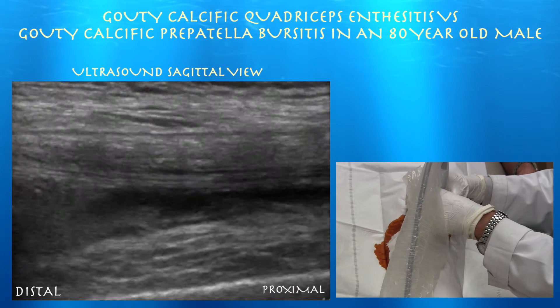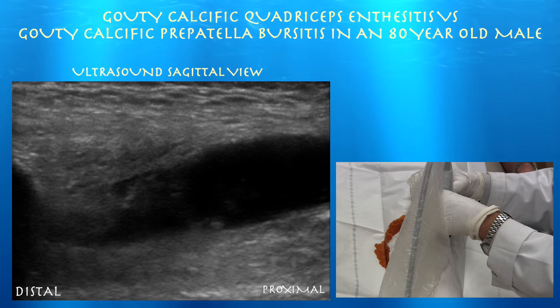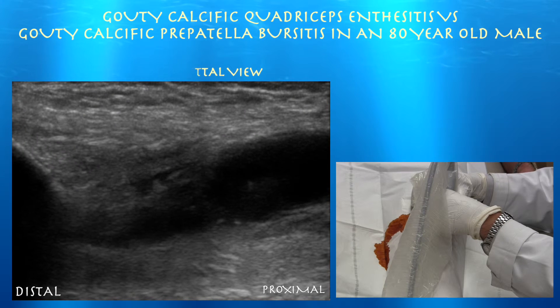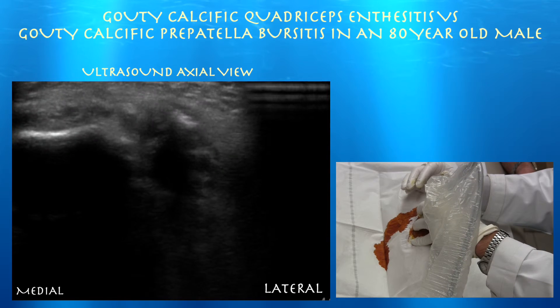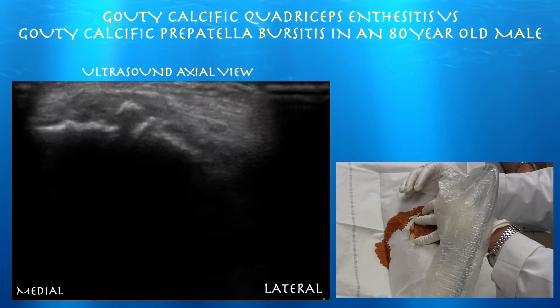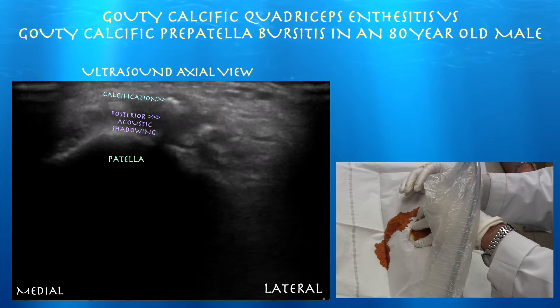He does have a fair amount of fluid in the knee joint. Here's the lateral suprapatellar view — you can see a fair amount of fluid in the joint itself. We're now in short axis or axial view of the quad tendon; right side of the screen is lateral. We've got his patella, and you can see some of that calcification laterally. Here's some posterior acoustic shadowing, which you may confuse for fluid — that's just shadowing from the calcium.